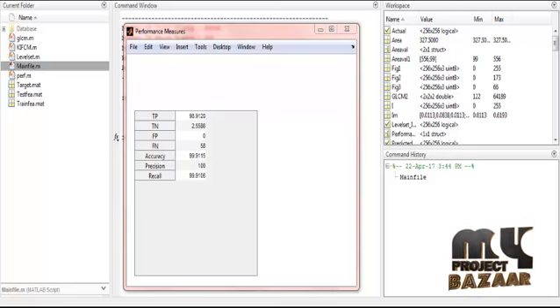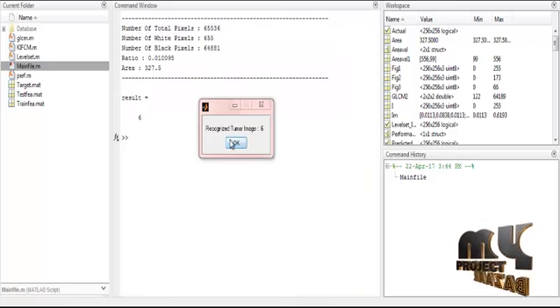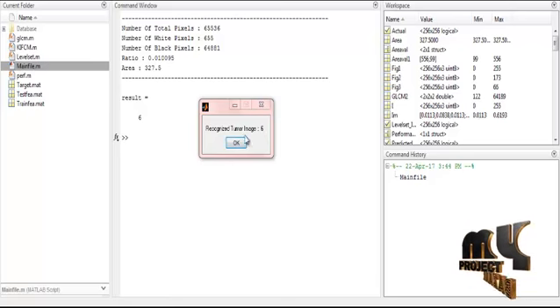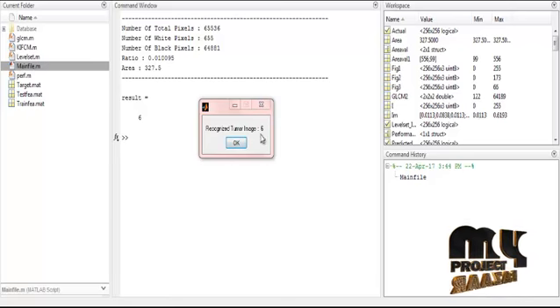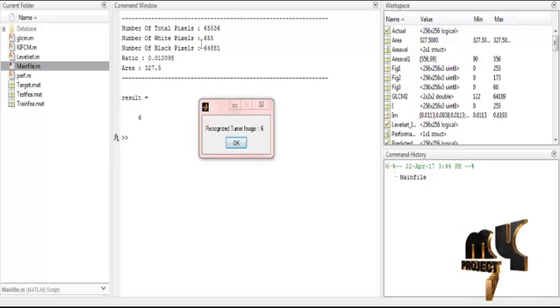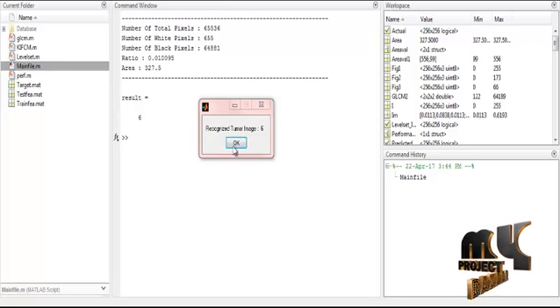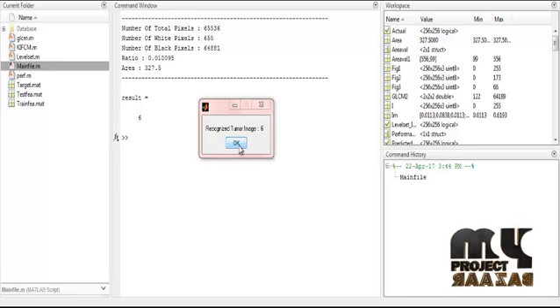And then finally we calculate which region should be detected, that is the tumor region. In the first step I select the sixth image of the dataset. So the tumor image is the sixth, and the result should be 6. The total number of pixels is identified, the white and black spaces, and so the ratio and area. This is the tumor ratio and the area of the process. So these are the overall running procedures for the project.